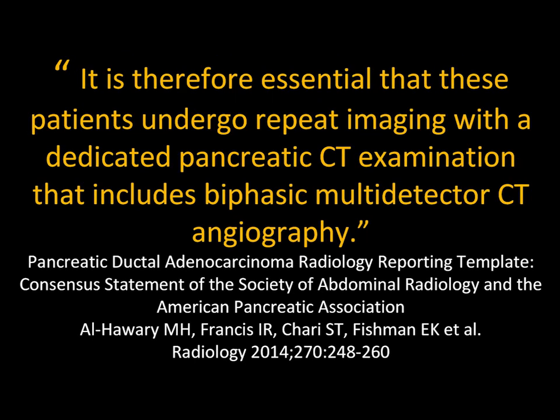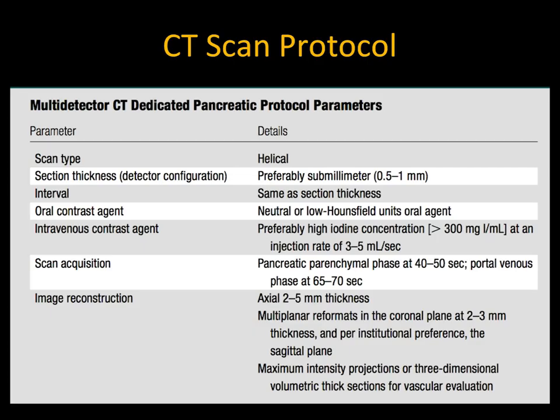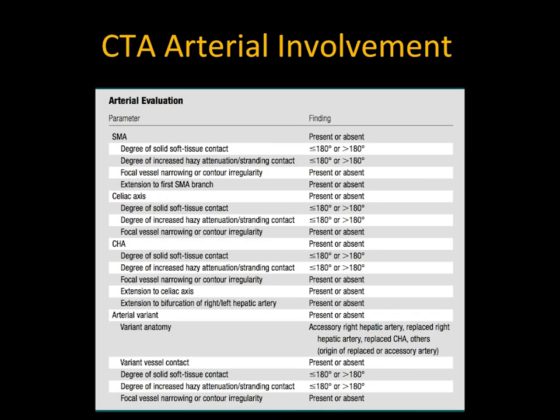It is critical if you want to do multi-center or even one-center trials. This article even made the point that if someone did not get thin section CT, it should be redone so they can get 3D mapping for preoperative planning. And so in that article, where the key was to talk about designing templates, we spoke about protocols. Here's how we acquire the data.